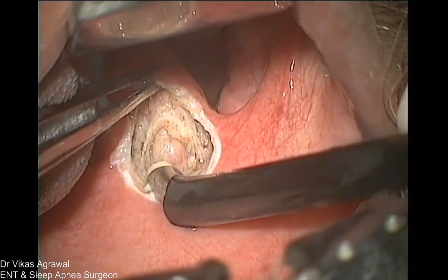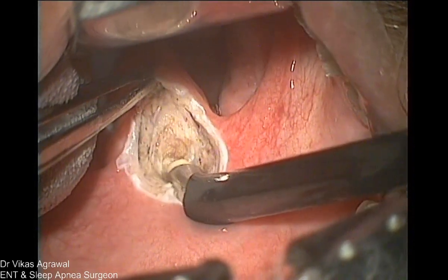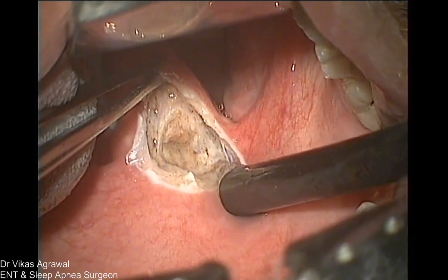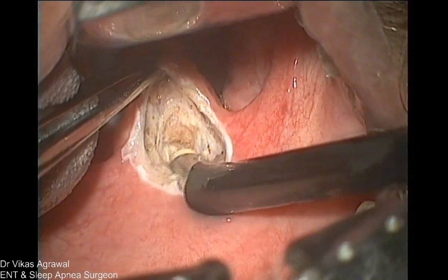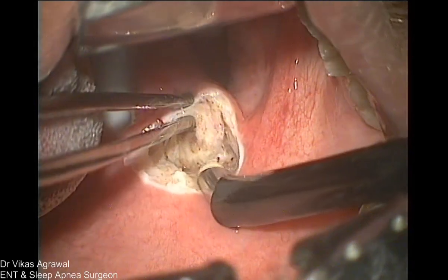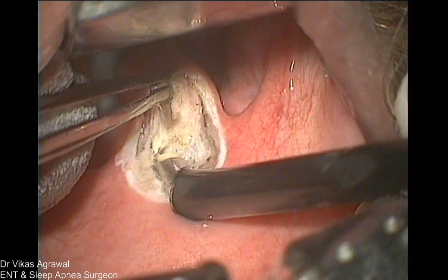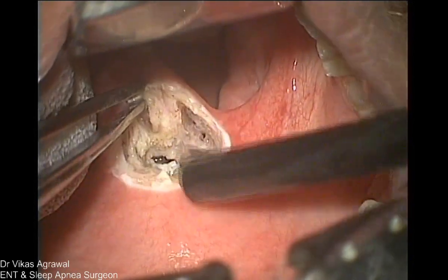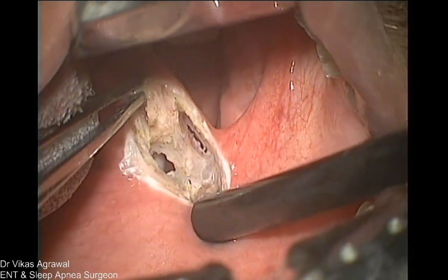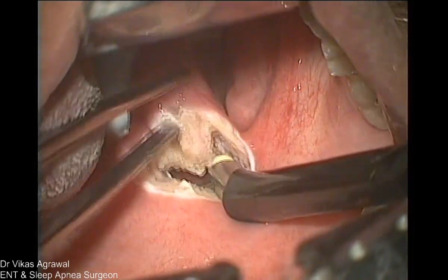Dr. Nilesh Chordia. Can you see the musculus uvuli very nicely? There was a superior pole vessel on each side. But then those vessels are not really so big. This is the huge musculus uvuli, which I removed. Now, just to make sure that there is no superior pole vessel here, I am coagulating first, and then I am going on to the right side.